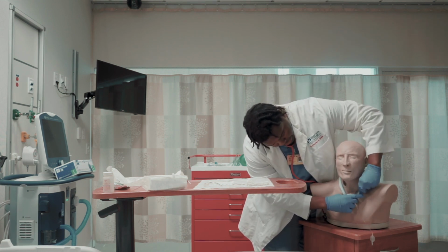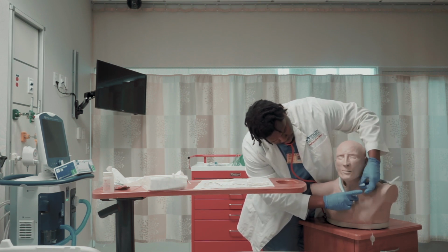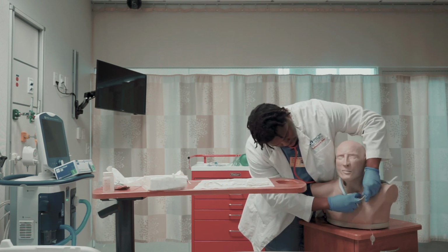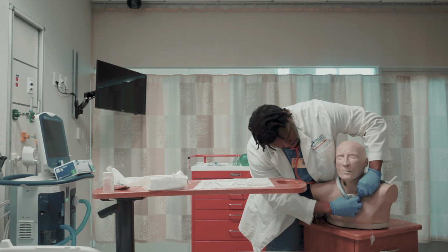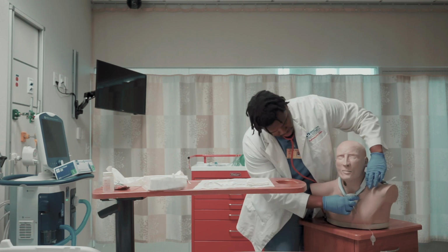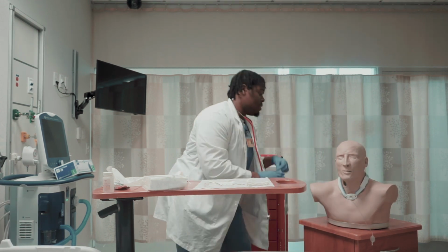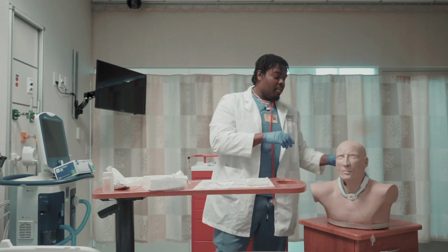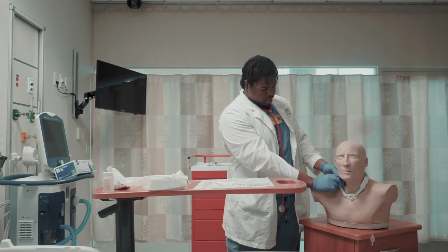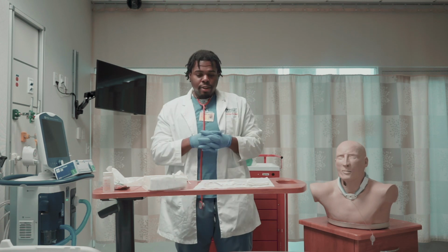Holding down his flange. I'm going to make sure that it's secured. I'm going to throw this in the garbage. I'm going to make sure that it's secured with the two-finger maneuver. Okay, the tracheostomy tie is secured.